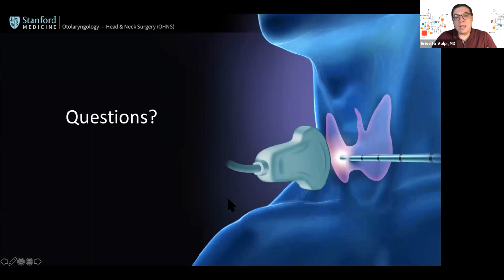Perhaps even for huge nodules, sometimes the patient will need 2 or 3 sessions. For very huge nodules, we try to optimize and use the needle as much as we can. So it's the same. We try to treat 2 or 3 nodules at the same time if possible.